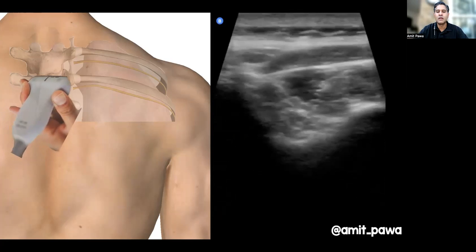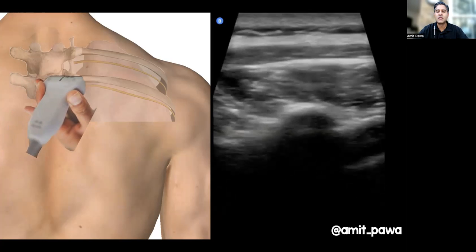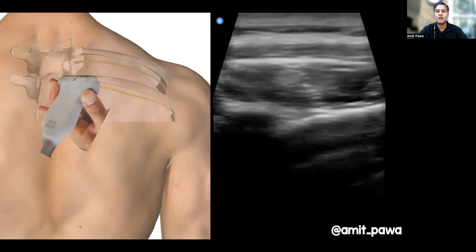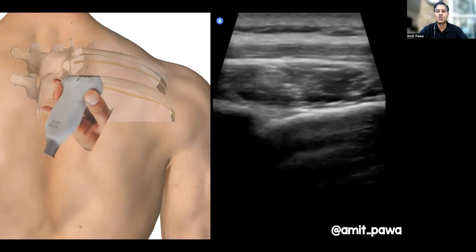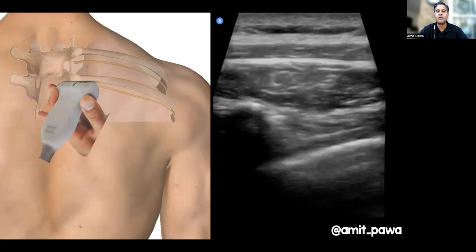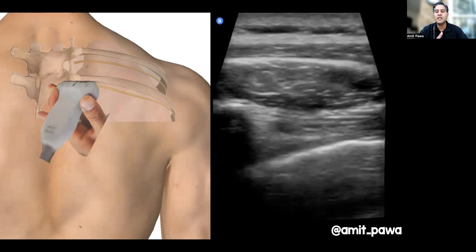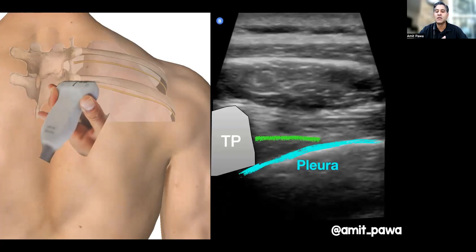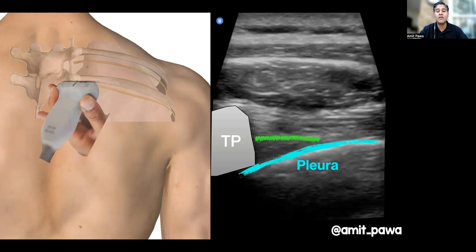Let's see that process happening: spinous process, lamina, transverse process coming over the long axis of the rib. At this point I bring the probe down and try to ensure I maintain the transverse process on the medial aspect of the screen so I know the probe is not going too medial towards the central neural axis. Here you can appreciate the difference between the rib and the pleura, with the internal intercostal membrane acting as that gateway into the paravertebral space — but actually, maybe not as much of a gateway as we thought.